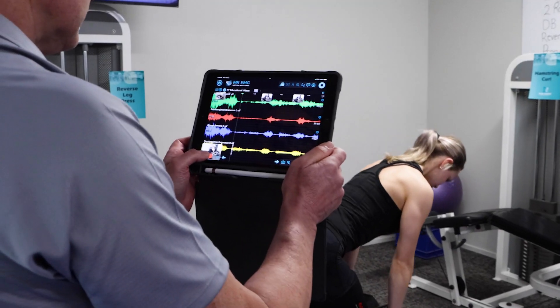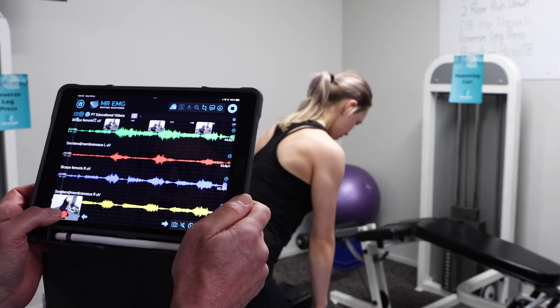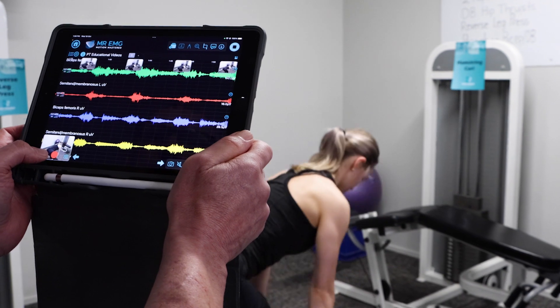Next we will test 40 kilo stiff leg deadlifts. Tempo is key here to ensure mechanical stress is placed on the hamstrings.